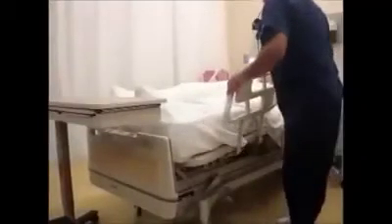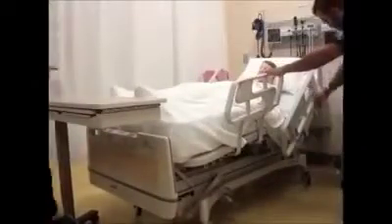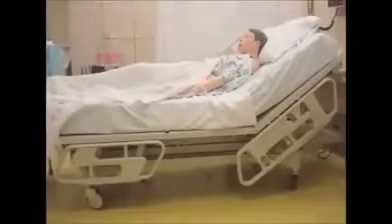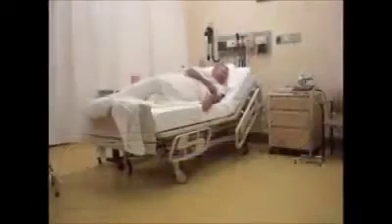All the rails up are considered restraining the patient in bed. Leaving the rails down puts the patient at risk for falls when they turn while sleeping.